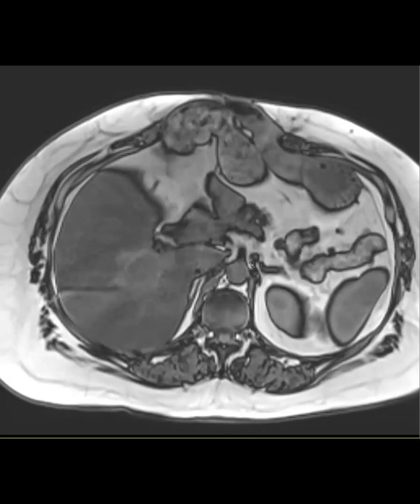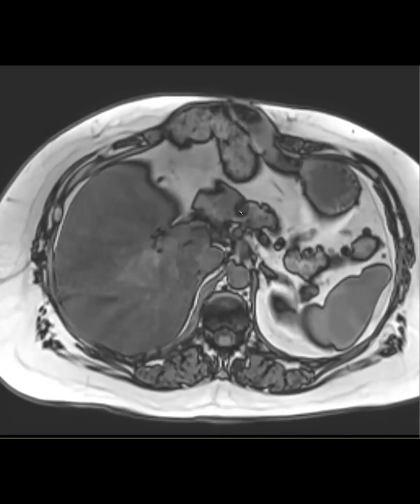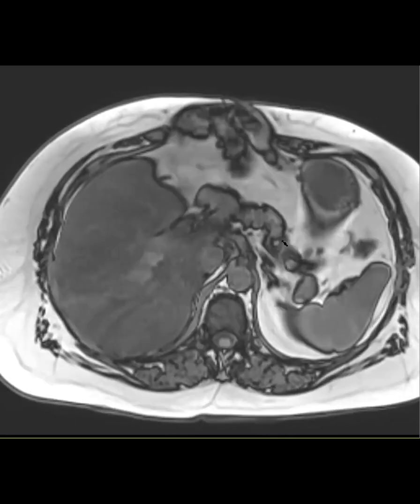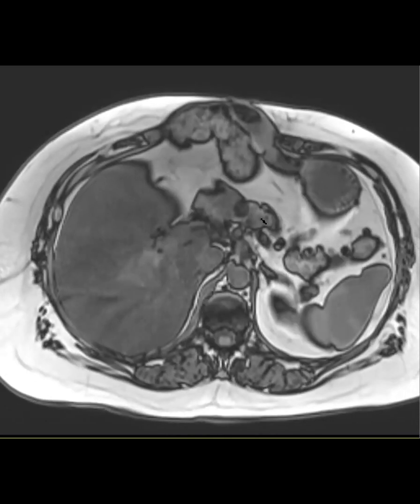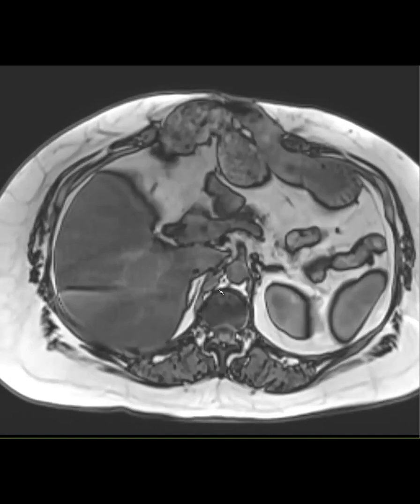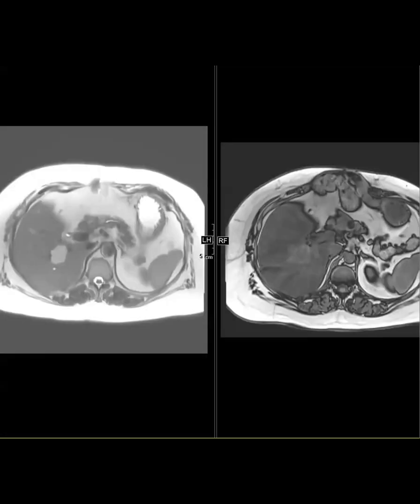So just to remind ourselves that clear cell RCC can have intravoxel fat, and they like to met to the pancreas, which I haven't truly figured out why, but I think it's because it's very vascular, and it also has the receptors that will take an RCC met. This is something that we've seen in our practice a lot, but sometimes miss because it can blend in with the pancreas on other sequences.